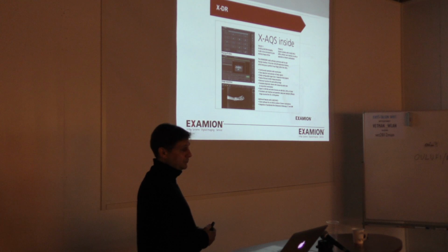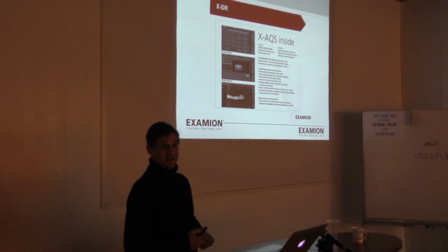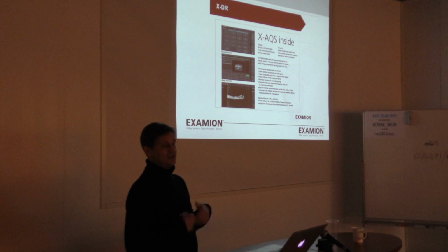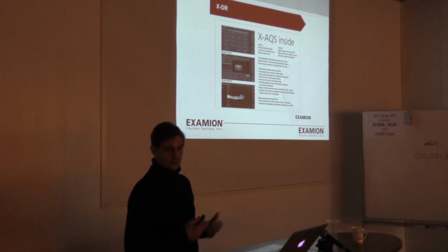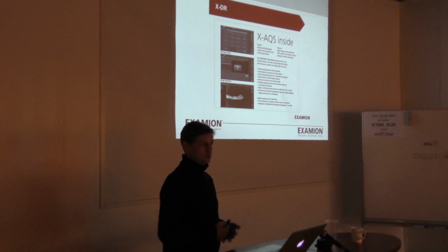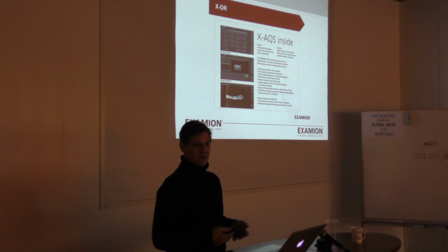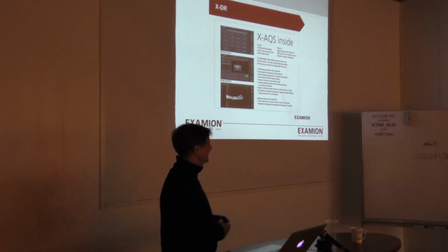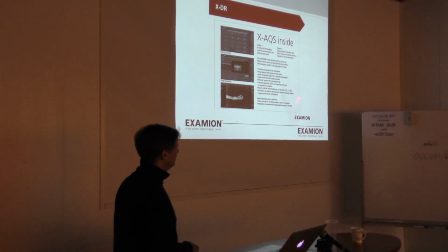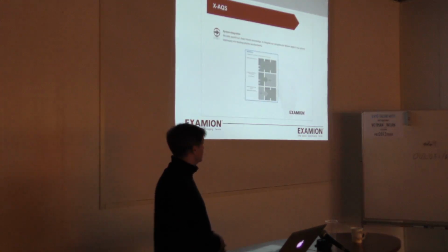In Switzerland, we cannot put them in the cloud, for example, because the government does not allow medical data, even for veterinary, to be sent outside the country, like on computers in China or the US, which is often the case. Because if something goes wrong, you do not have any law behind you to say, I need my images back, these are private data. So there are some reasons we have to take care of, but again, it's modular and can be adjusted.